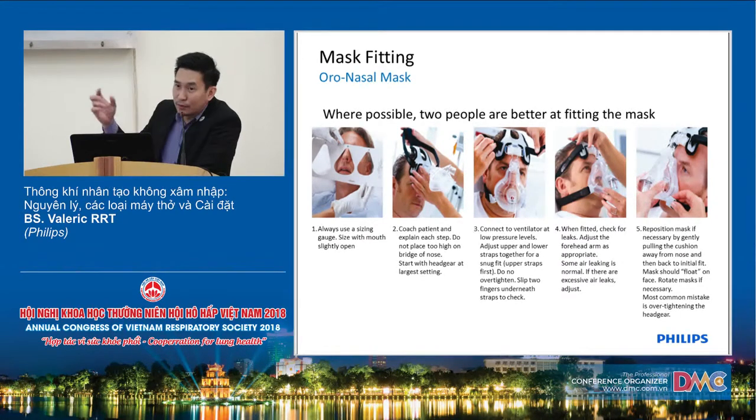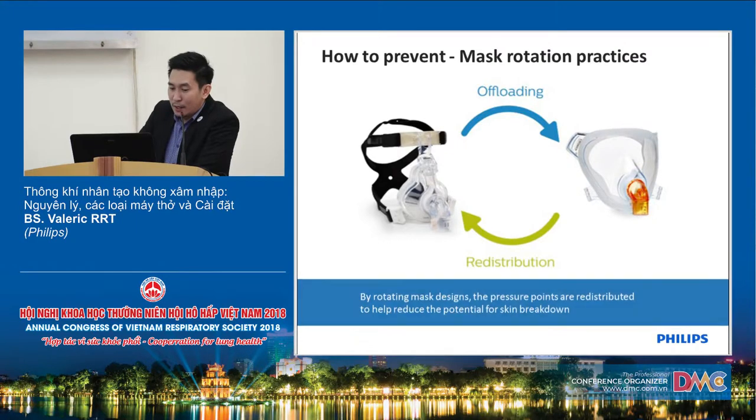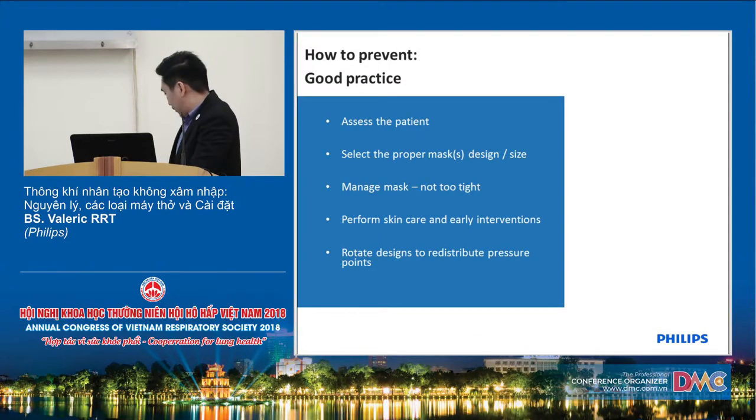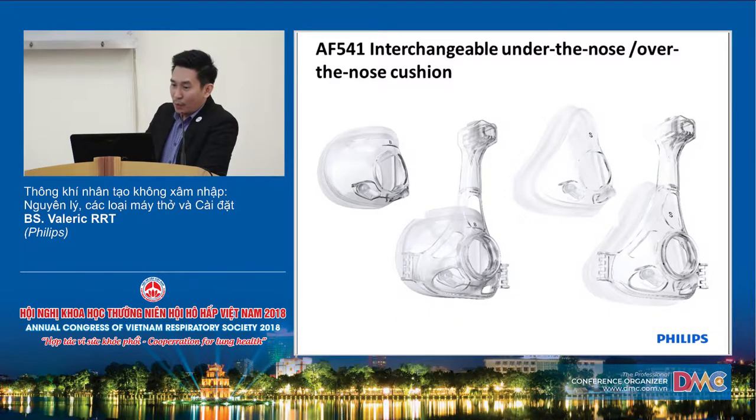So we have different sizing tools here to properly fit the oral nasal mask. And for mask fitting, this one is the correct one, and the rotation, like what I said earlier. So this one will be your topic, right? This one is the AF541 mask.